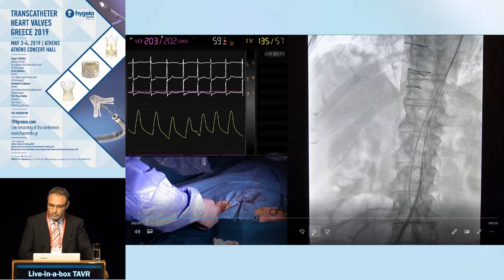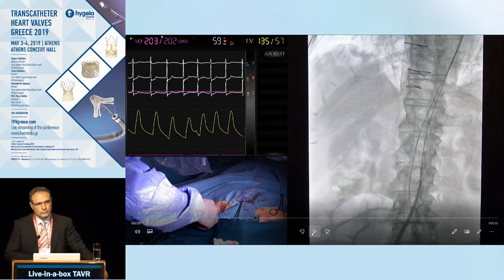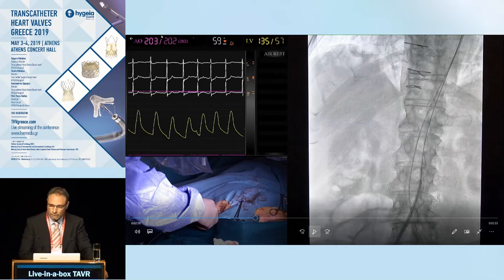Okay. In the other cases it is easier to find the left carotid from the ascending aorta, so we don't manipulate it in the ostium of the innominate essentially. Yeah, I understand, but that's what I'm saying, I just want to make clear to whoever is watching that this may be particularly helpful here, but it's not the general way that this device is used.